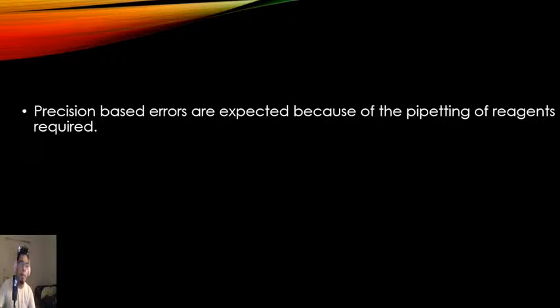And then Mayra Gagaso added a result of 34.9, Charis added 34.8, and Ana followed with 35.1. So imprecision basically means that some of the people in the laboratory are not doing the same procedures or have mistakenly performed the procedure. Because again, manual methodologies are more likely to produce precision-based errors.